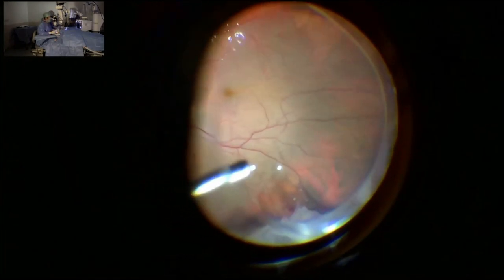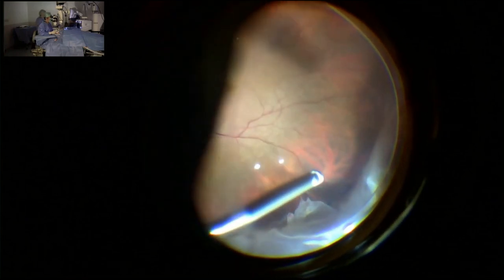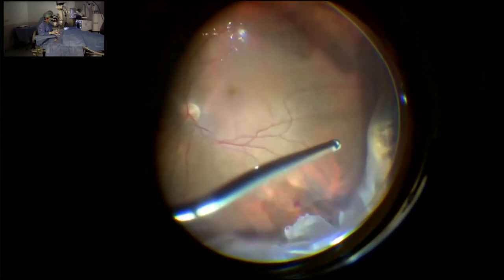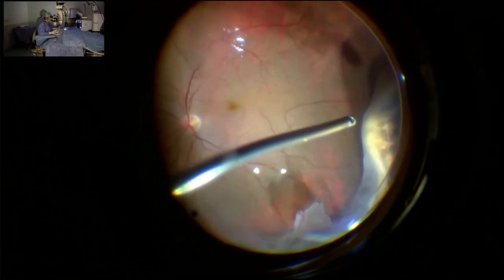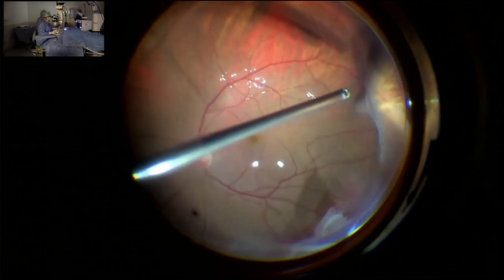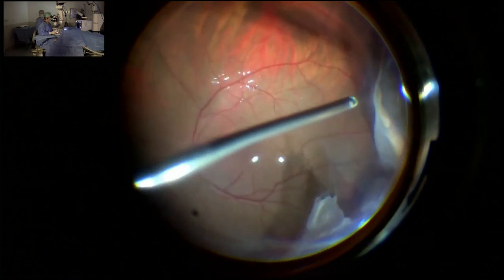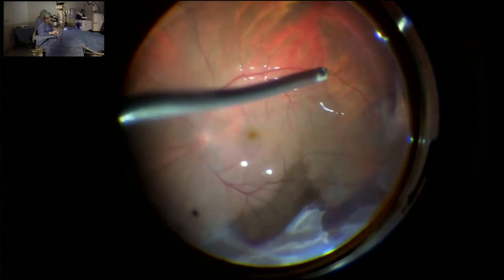So we will start to clean the vitreous base with indentation. After rough vitreous base cleaning, I prefer vitreous base shaving to clean all the vitreous on the vitreous base. I think you can see the indentation clearly. I do my own indentation. Usually I do not like assistant indentation.